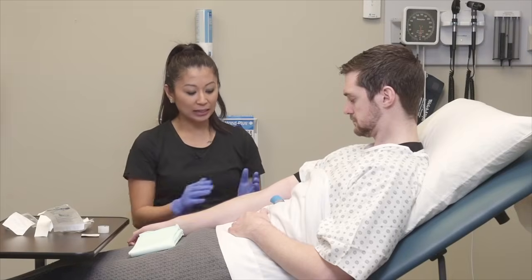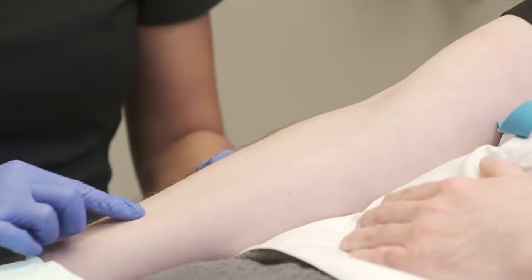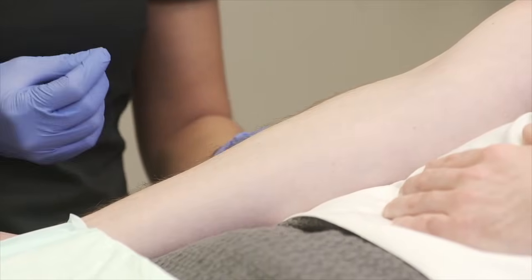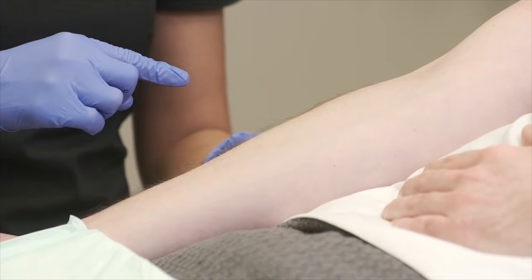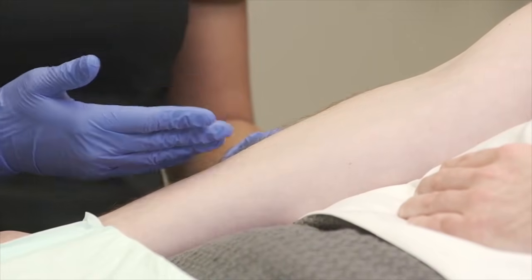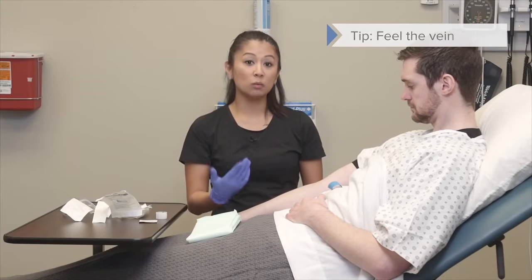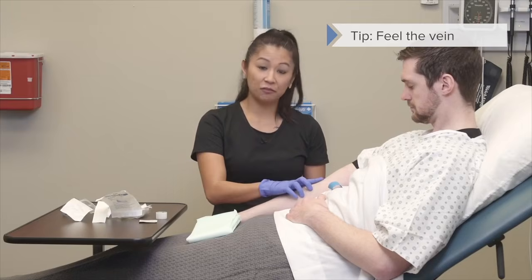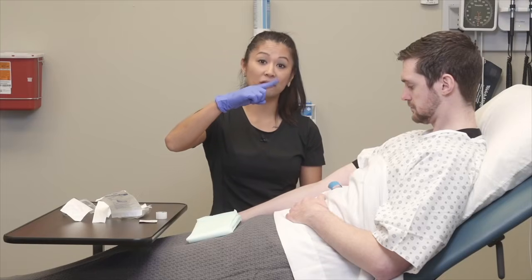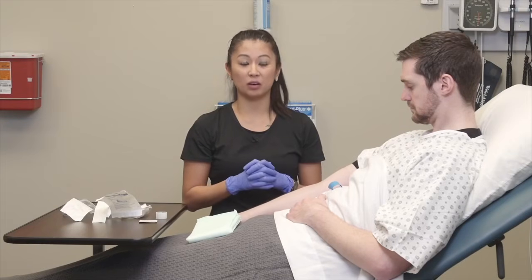All right, so again, here's the other thing about IVs: you can see on Peter's arm lots of coloration of what the vein would look like. That doesn't mean it's going to be a great vein to puncture. So let me say that again. You can see the different colors of where Peter's veins are here. Now the problem with that is it doesn't mean it's good for IV insertion. So we want to go by feel. So when we go by feel, when the tourniquet's on, when we use our finger and push, or what we call palpate the vein, you should feel a nice little bounce. That's what we want. So that's the vein to go for.